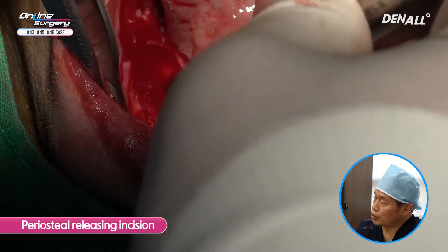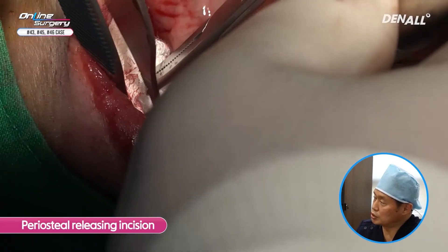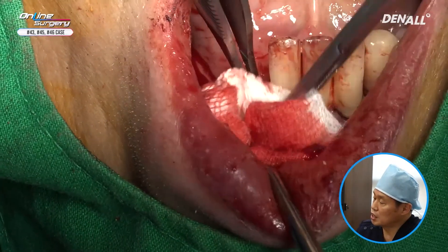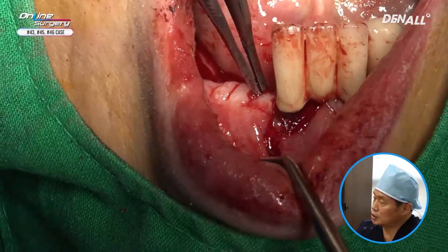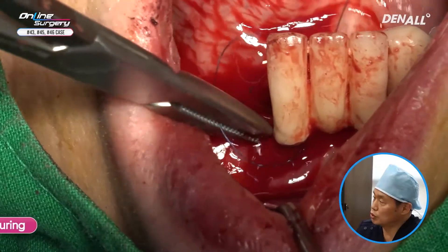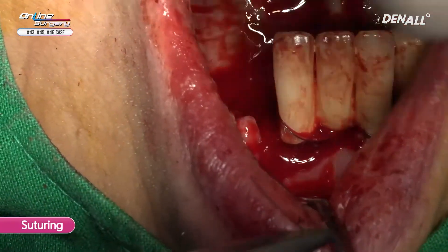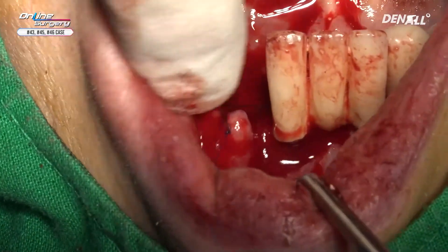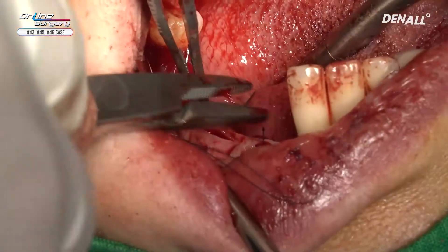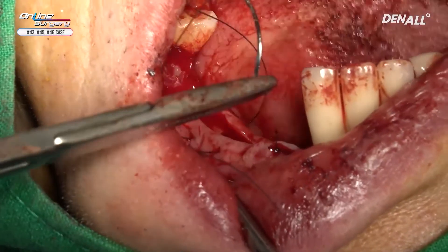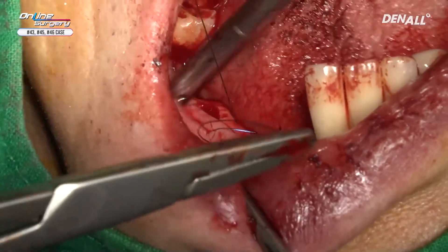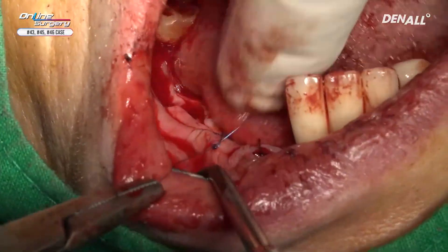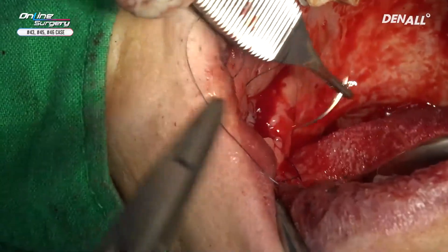A periosteal releasing incision is done. The area where augmentation was done with OsBuilder — tension-free suture is going to be done. This is where the mental nerve is, so you need to pay extra attention and be careful about the release.